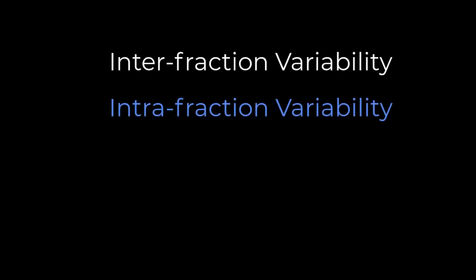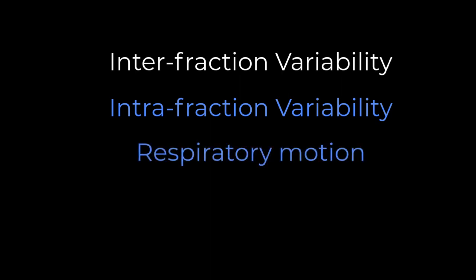But let me jump now to intrafraction variability. So variability and motion that happens on a shorter time scale during a treatment fraction. And again, there's varieties of this, but I'm going to focus the rest of this discussion specifically on respiratory motion because that is very important to understand.